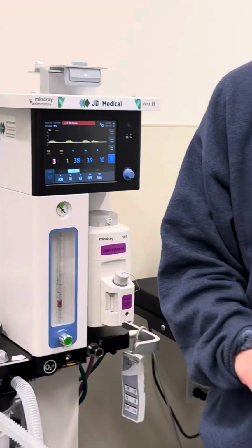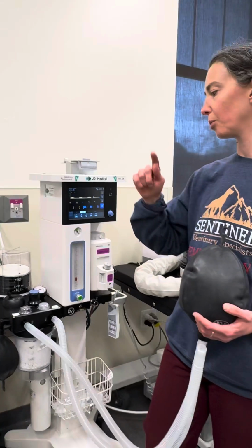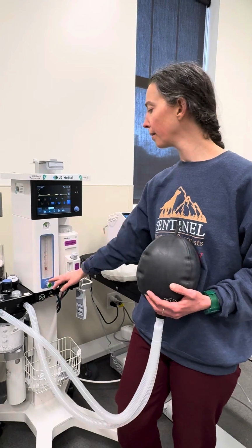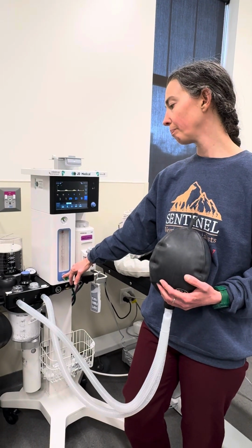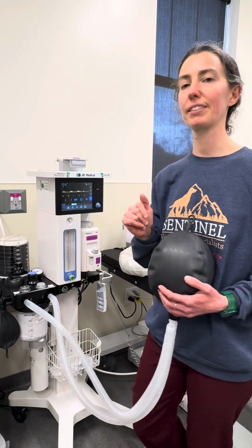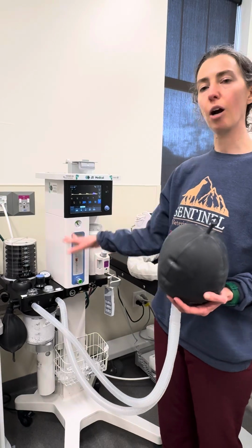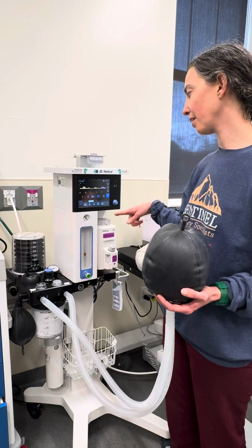Now it's giving us another airway pressure alarm. So it says PAW too low. PAW means the pressure in the airway is too low, so you probably have a leak somewhere in your circuit. I'm going to turn this up and just fill up our bellows because probably when I was pretending to be a dog that was waking up as somebody was stabbing its belly, it got mad. Okay. So we'll go back to a liter a minute. Our bellows are back to going to the top at the end of each breath.